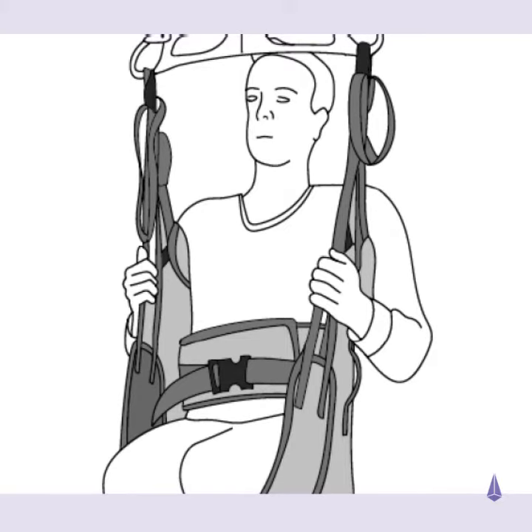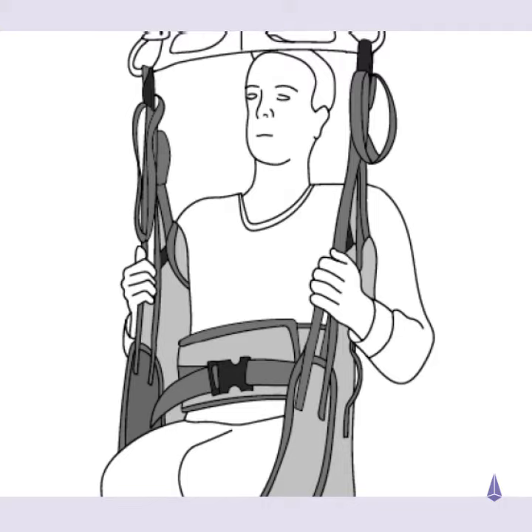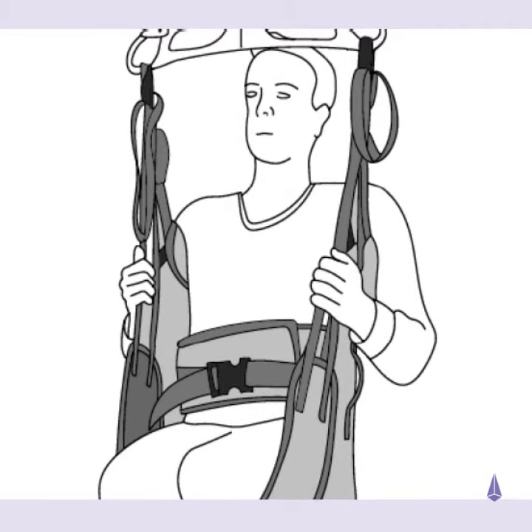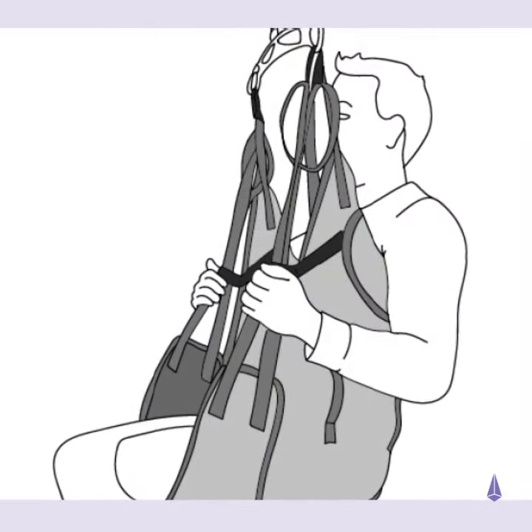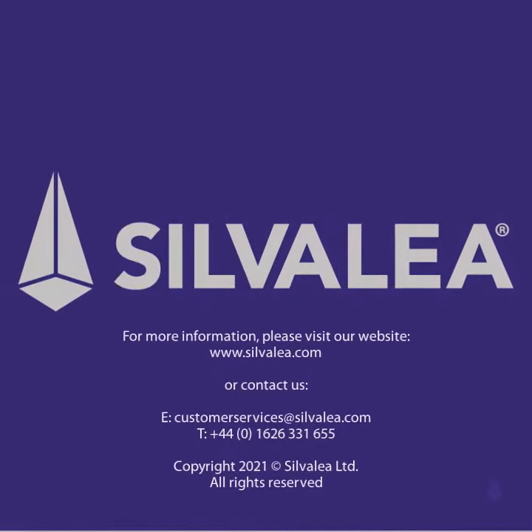With the patient's arms on the outside of the sling, if preferred, attach all tapes to the hoist. Use the appropriate corresponding colored loops for the required positioning. Ensure that all tapes are secure before commencing the transfer.